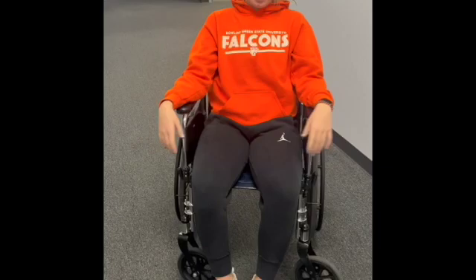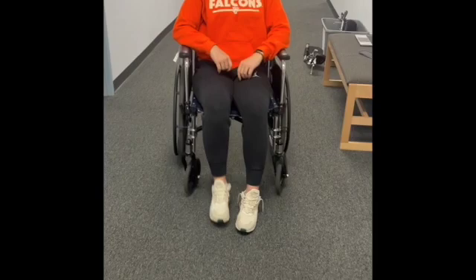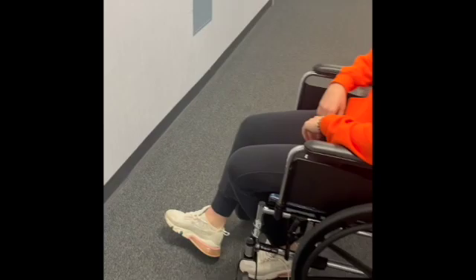If you can't use your hands, you can use your feet — you can just walk the wheelchair along. If you want to go backwards, just make sure you know where you're going. You can turn this way too.